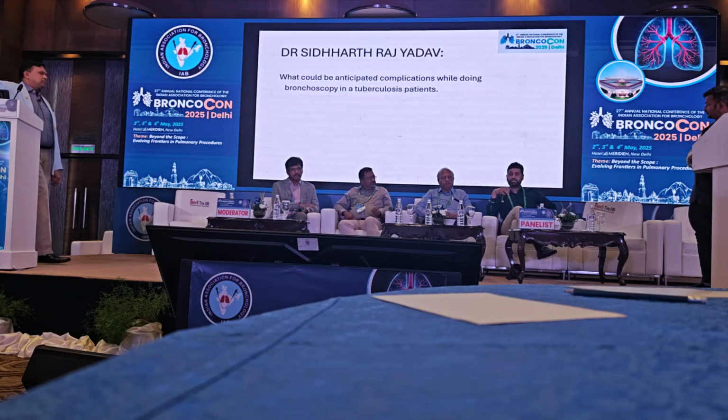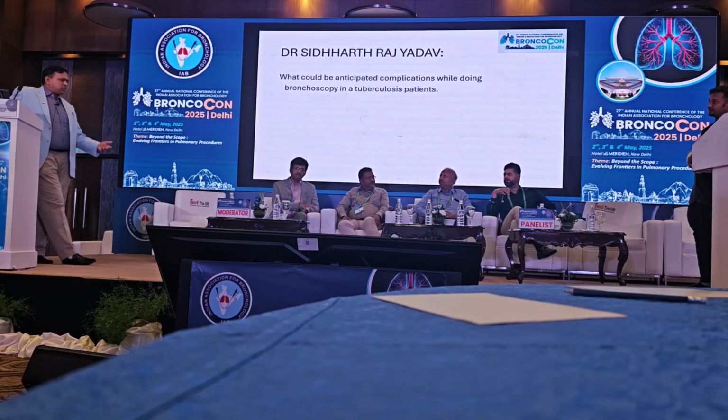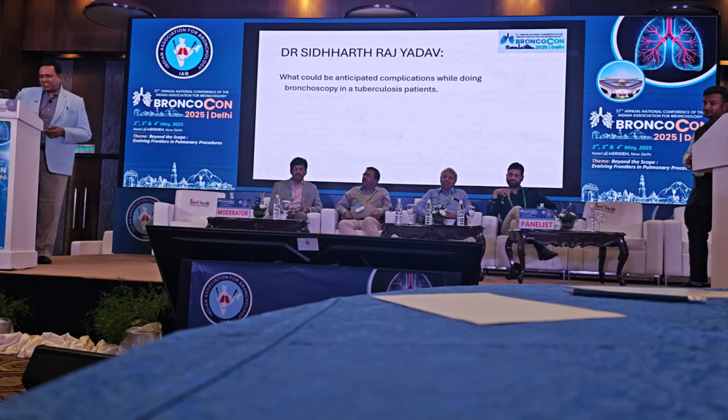The other important thing is the healthcare-related one, because we all know that doing bronchoscopy in a patient with tuberculosis leads to aerosol generation. So wearing personal protective kits is very important in those scenarios, and it can lead to transmission of infection in healthcare workers. So these are the basic complications. And some anesthesia-related complications also. We are not experts in that, but they do occur.